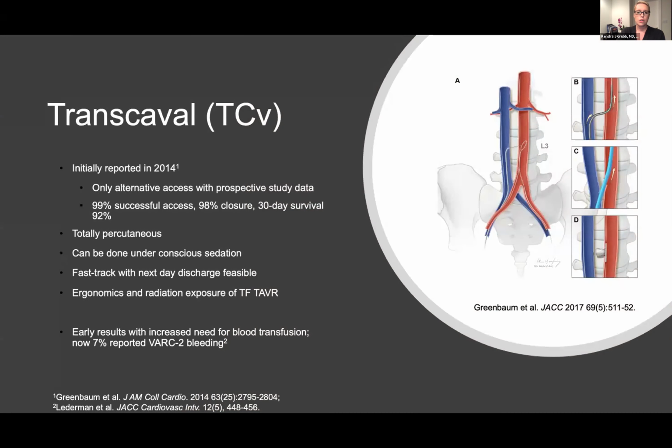Transcaval, it happens to be that transcaval is our alternative access of choice at Emory. So I'm a little bit biased, but I'll explain to you why.